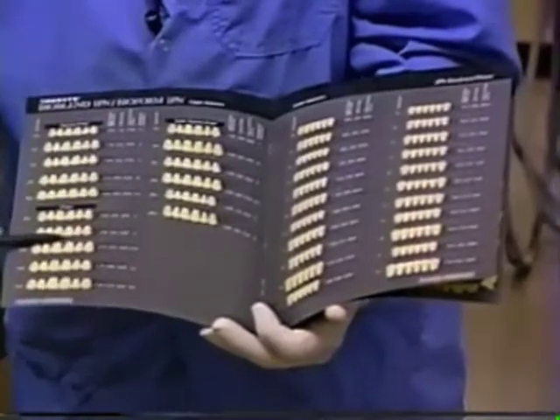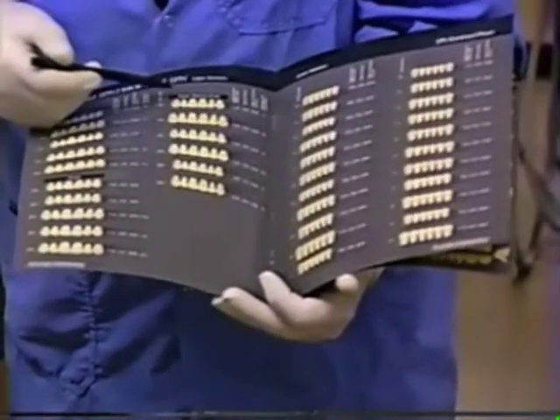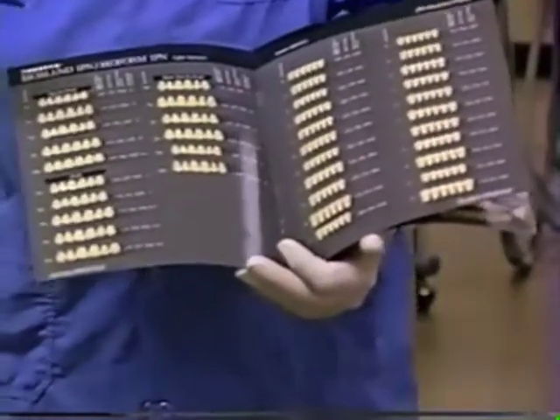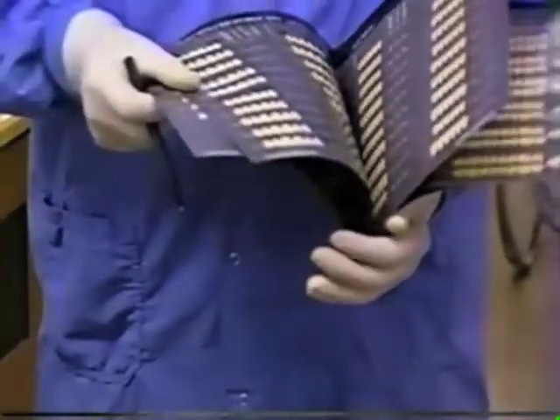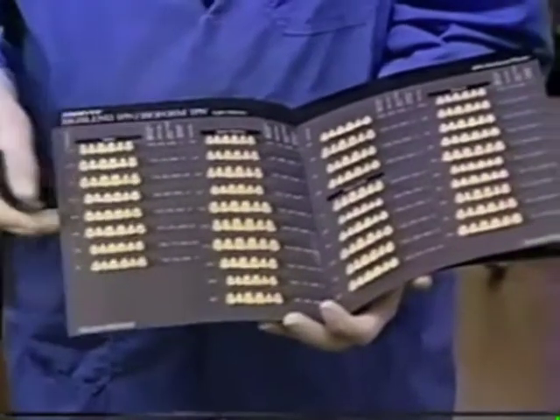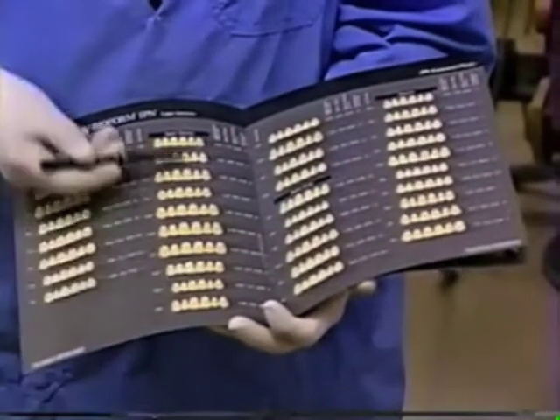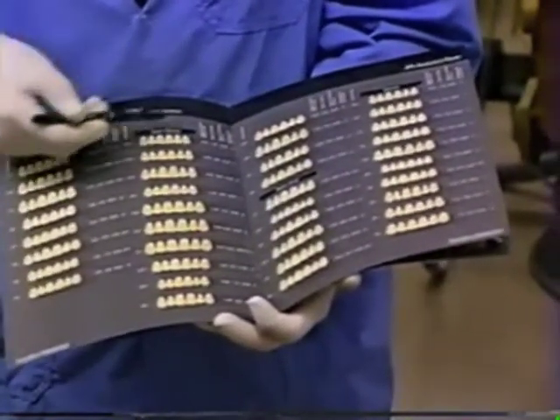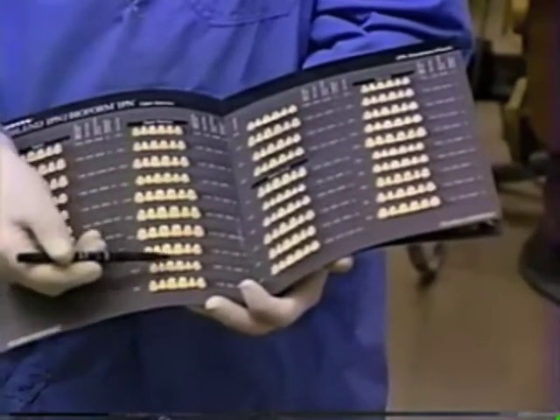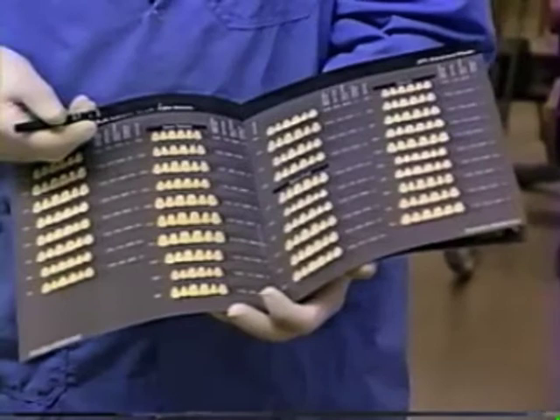The catalog also shows tapering ovoid teeth, ovoid teeth, and a group that are square tapering ovoid with all characteristics combined. Our patient is basically square tapering, so the square tapering category should give us something close to what we'd like.